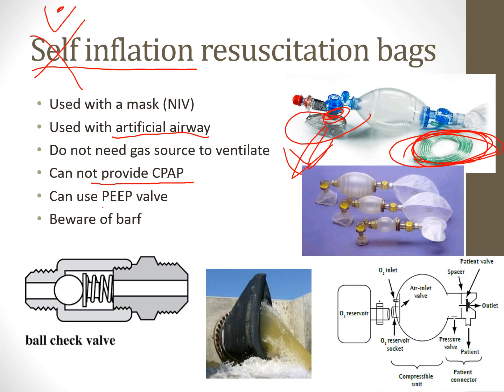Flow inflation bags also give a specific FiO2 if we hook them up to a blender. And we can also feel lung compliance. There are a lot of advantages to flow inflation bags, but self-inflation bags cannot provide continuous airway pressure.